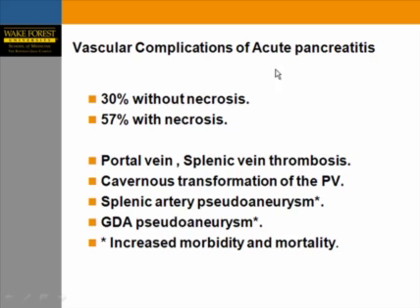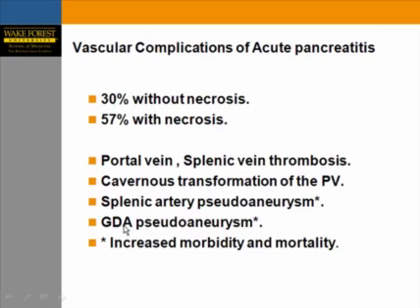Vascular complications of acute pancreatitis can be evaluated with color Doppler — seen in 30% of cases without necrosis and 57% with parenchymal necrosis. The most commonly involved vessels are the portal vein and splenic vein; complications include cavernous transformation as a result of portal vein occlusion. Arterial involvement commonly includes the splenic and gastroduodenal arteries. Aneurysms increase morbidity and mortality, so attention must be paid to exclude these vascular complications.